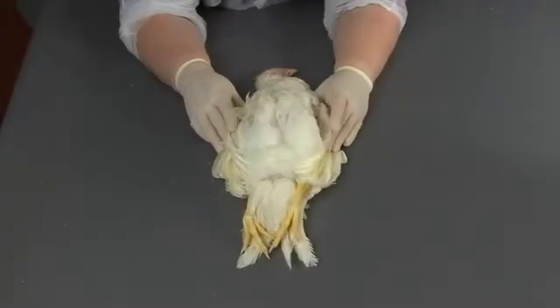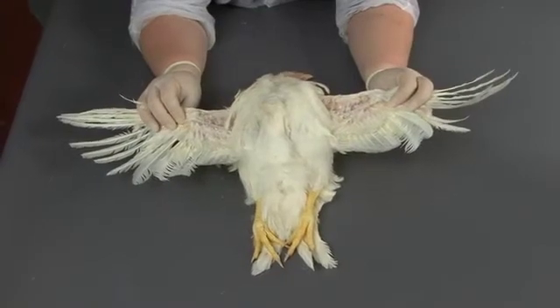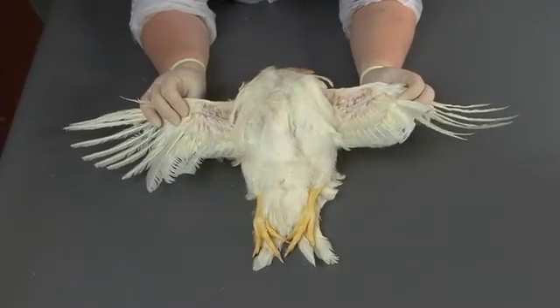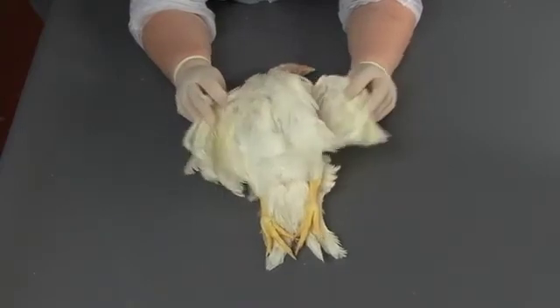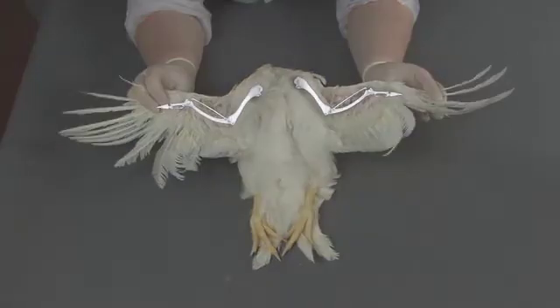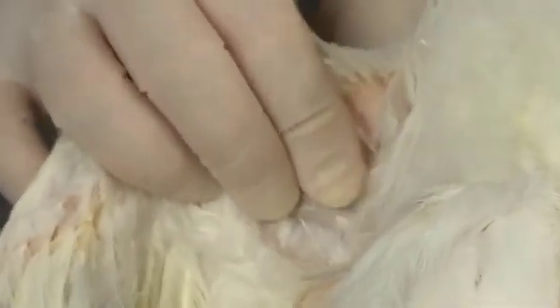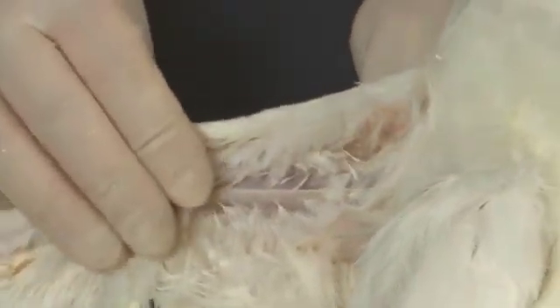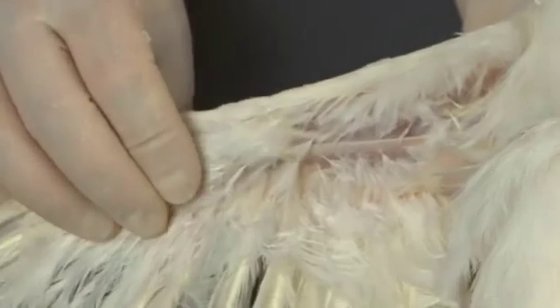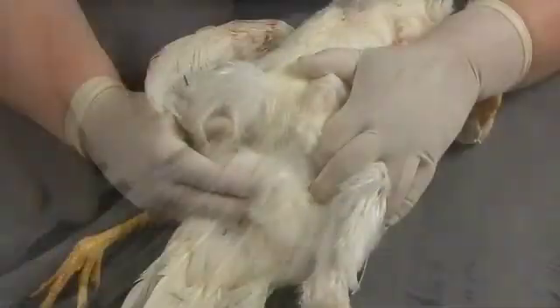Examine the wings. Begin by grasping the wings and extending the joints. The wings are normally very flexible and should easily extend outward. The right and left sides should be symmetrical. Palpate the deep structures of the wing, working systematically from the proximal aspect to the distal tips. Palpate for bony fractures, healed calluses, areas of inflammation, and other abnormalities.